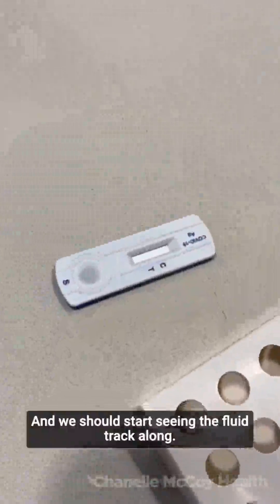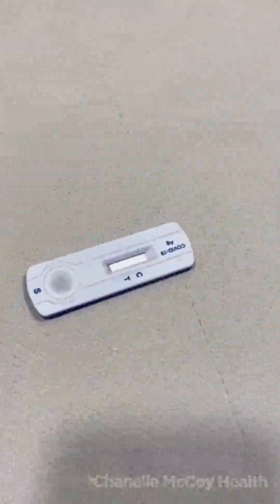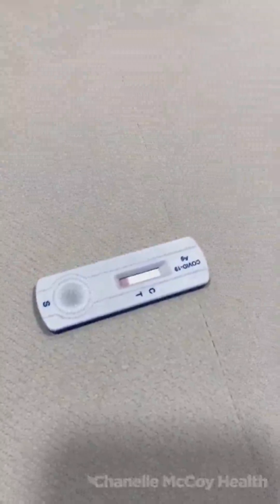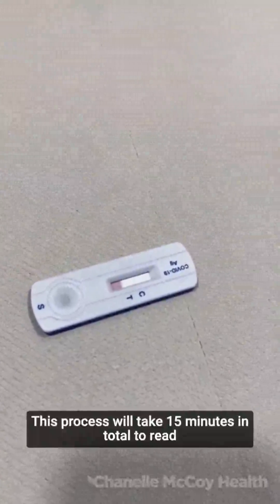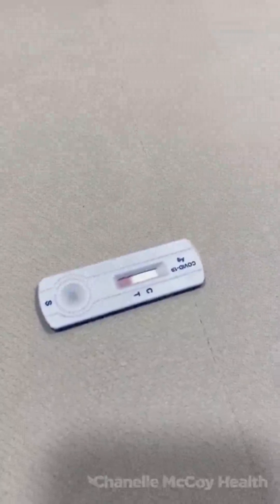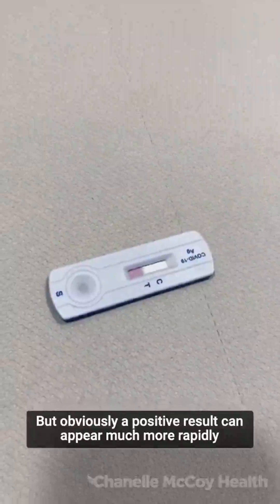We should start seeing the fluid track along. You can probably see the fluid now tracking along the test cassette. This process will take 15 minutes in total to read a true negative result, but a positive result can appear much more rapidly than that.